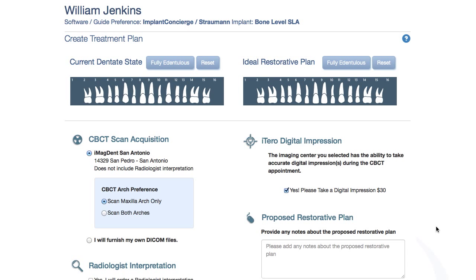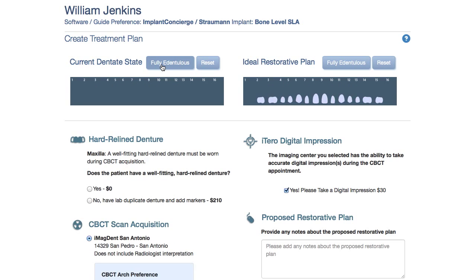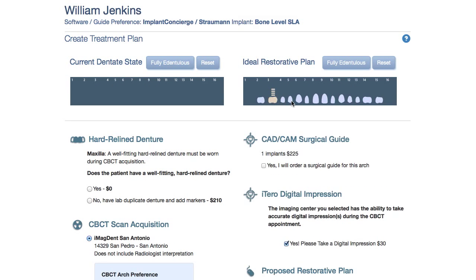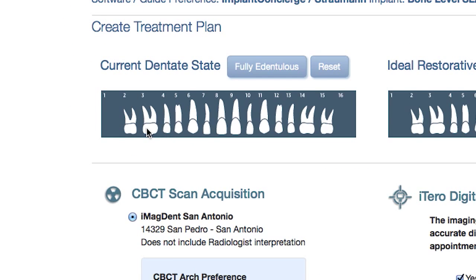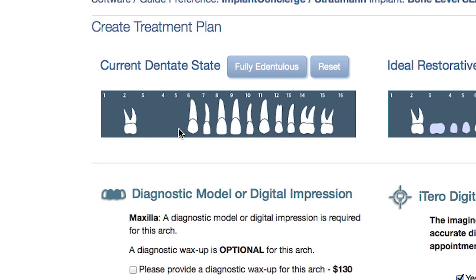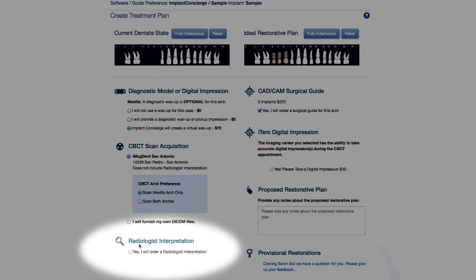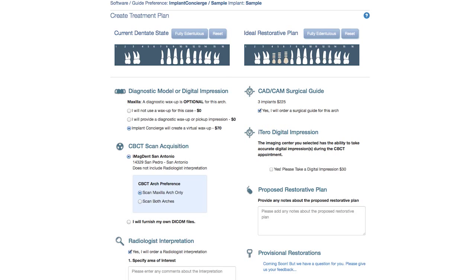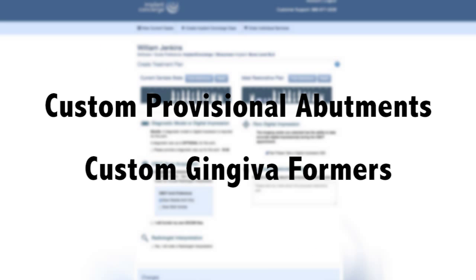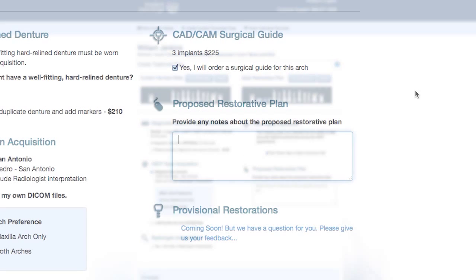For a fully edentulous case, click the fully edentulous button. The ideal restorative plan tooth chart allows you to communicate your ideal restorative treatment plan with your virtual 3D case coordinator. After carefully making your tooth chart selections, customize your online referral by selecting from options such as virtual diagnostic wax-ups, CAD-CAM surgical guides, radiology interpretation, and in select cases, you can also order surgery-ready custom provisional abutments, screw-retained full-contoured crowns, or custom gingiva formers.